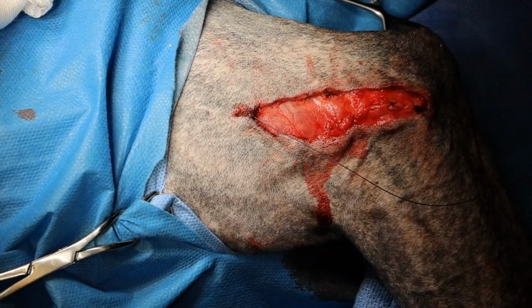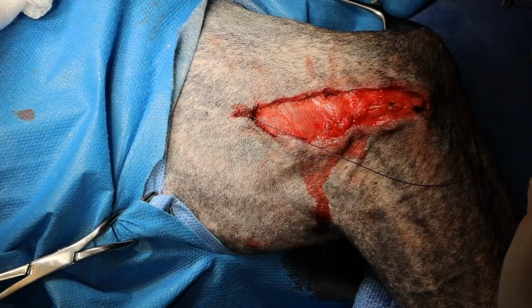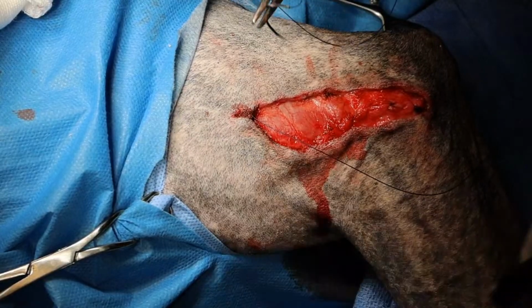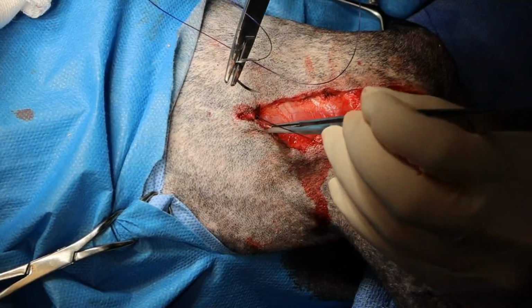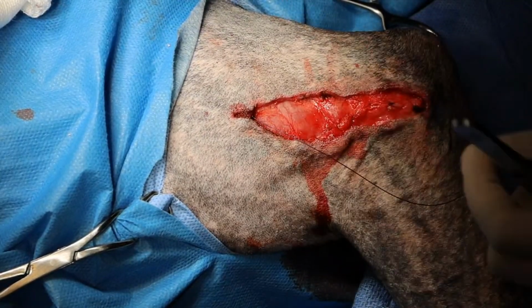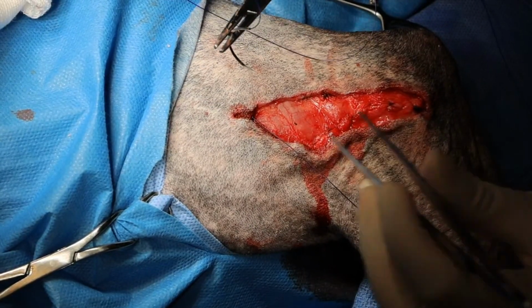Wound soaker, look, that wouldn't be a bad idea. We don't have good access to wound soakers here. I could use just a normal urinary catheter or something like that to soak the wound with bupivacaine in the postoperative period. I find that just an injection into the soft tissue to be adequate. Yeah, certainly wound soaker would be a consideration here as well.